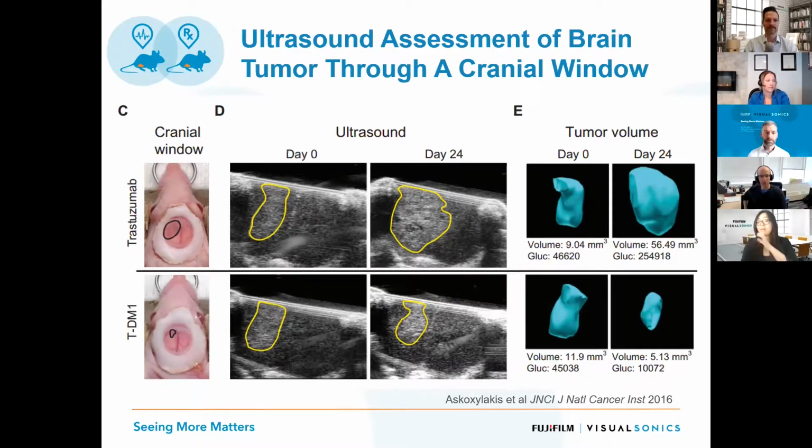So you're able to get that high anatomical resolution to track these millimeter tumors. This is just an example from the group. And again, as Kristiina has mentioned, the full list of publications is also available to you.